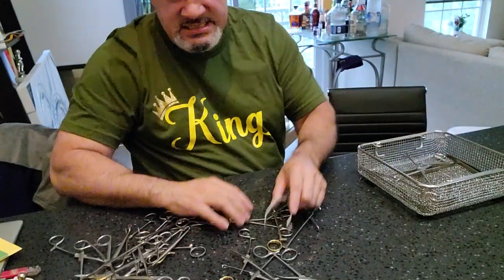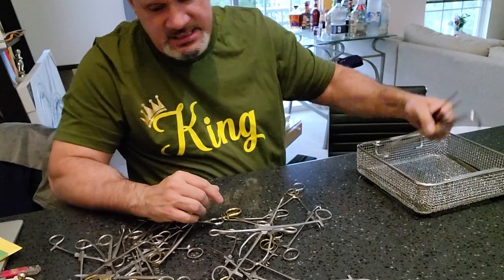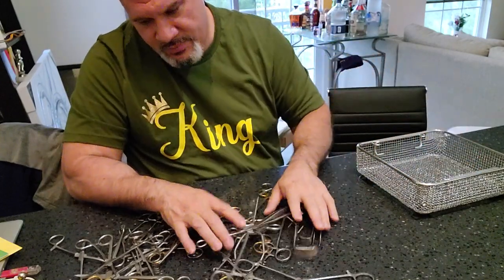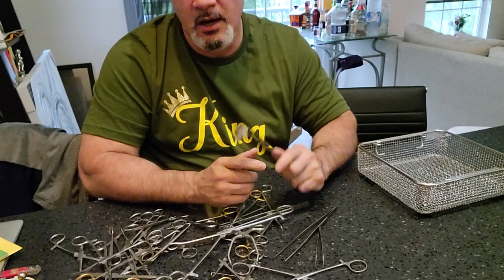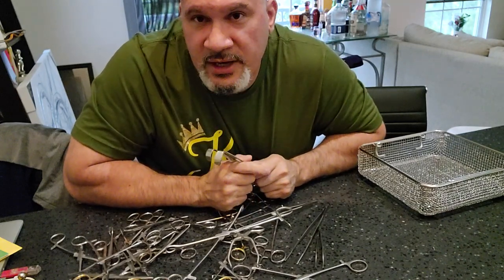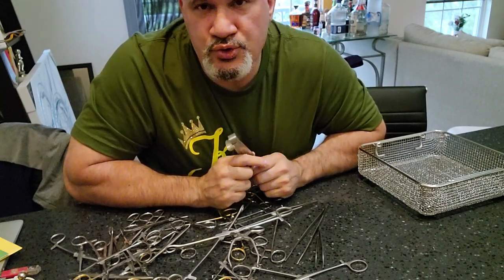Hey guys, welcome back to 'What Do You Do as a Central Sterile Processor.' I'm making a video because I've gotten so many comments stating that you should not be dumping instruments, and yet there is no documentation out there supporting that belief that you should not be dumping.